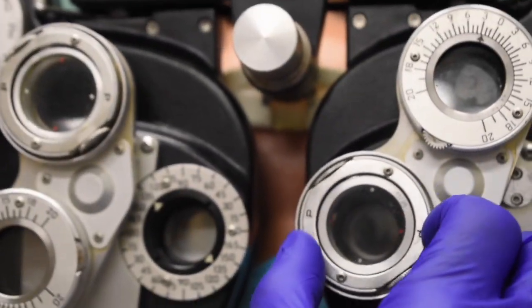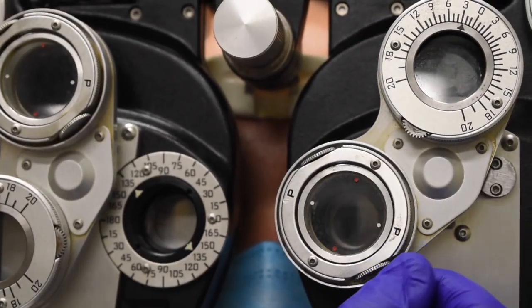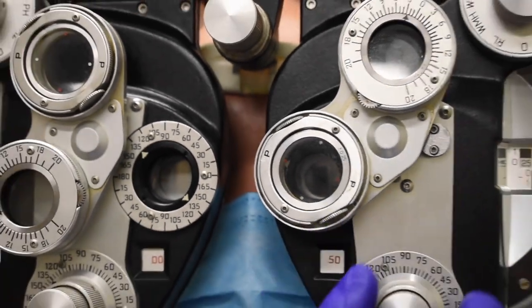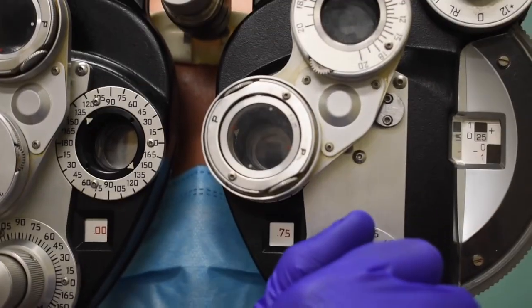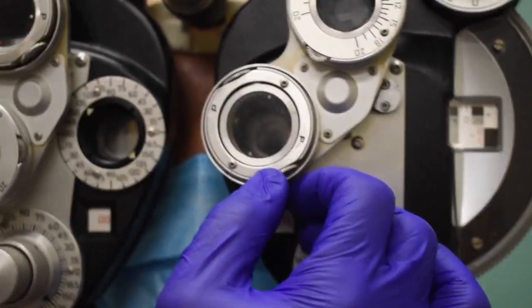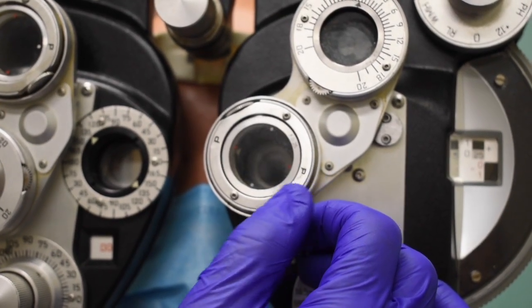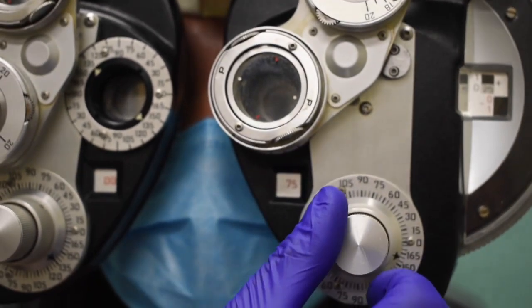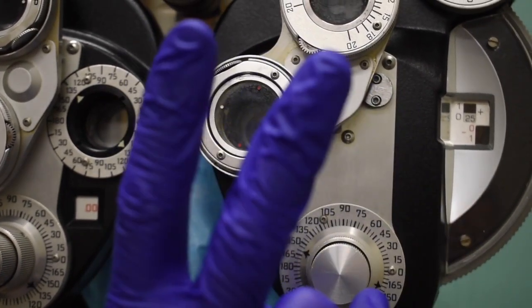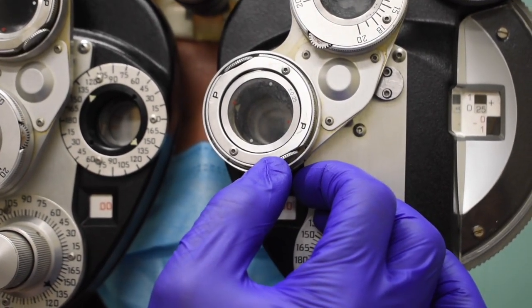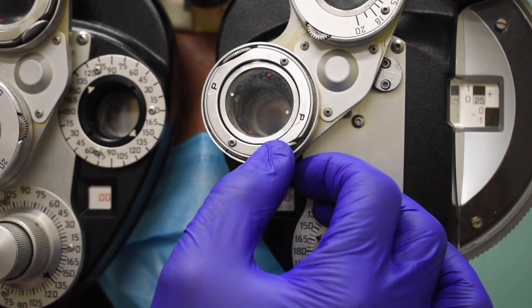Now we're going to go ahead and finish with our final power check. Is it more clear here with one or two? Two. Great. So she wants another quarter diopter of cylinder power. How about one here or two. One. Now she wants it out again because this is our second power check. We can go down. And how about one here or two. Two.